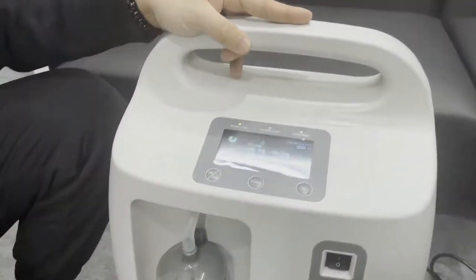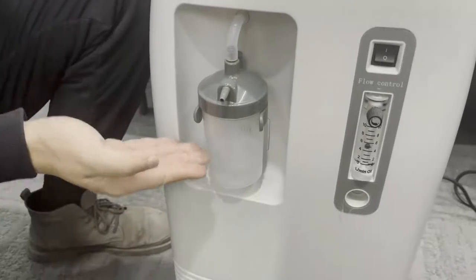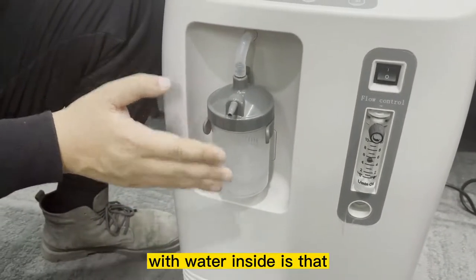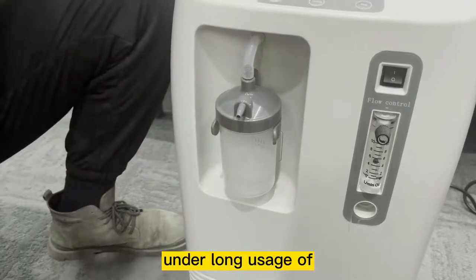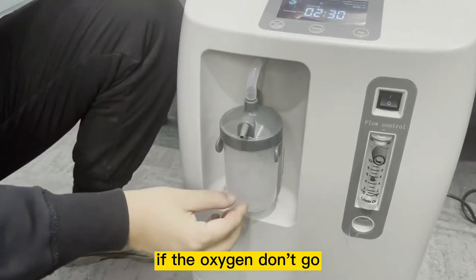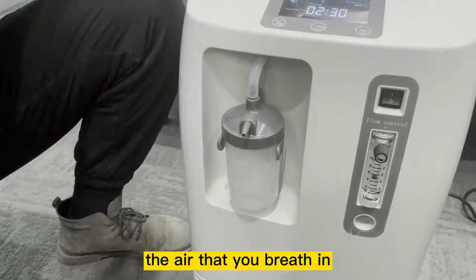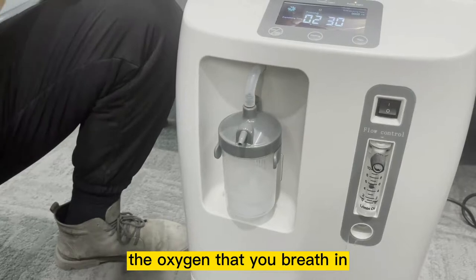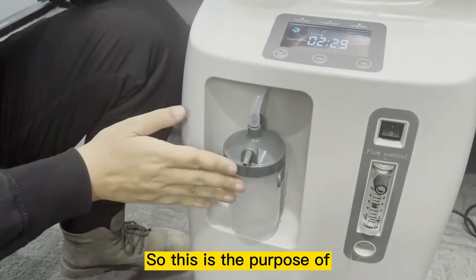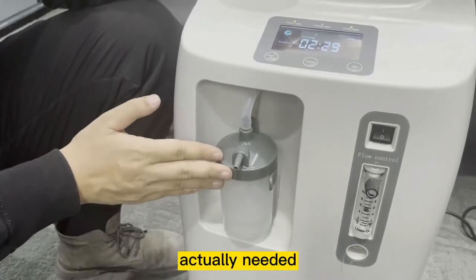You can see the humidifier bottle with water coming through it. The reason we use a humidifier bottle with water is that under long usage of inhaling oxygen, if the oxygen doesn't pass through water, the air you're breathing — the oxygen — might be dry and you may feel uncomfortable. This is the purpose of why a humidifier bottle is needed.